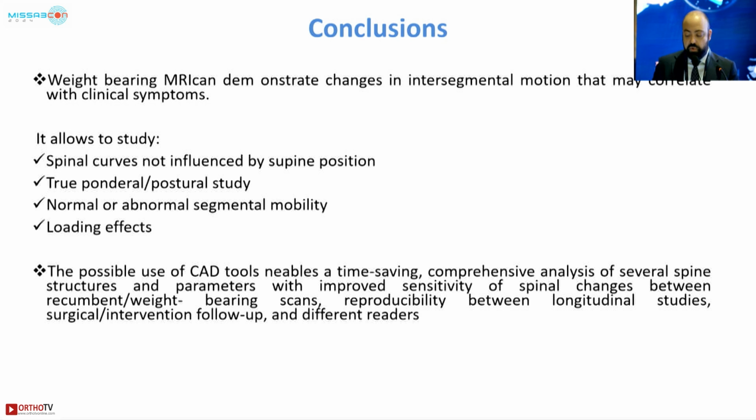So, coming to the conclusion, weight-bearing MRI is an approach that can demonstrate the biomechanical changes in the spine that can correlate more directly with clinical symptoms. It can evaluate the spinal curvature and the normal spinal anatomy in a postural way, and also the effects of loading on the pathology.